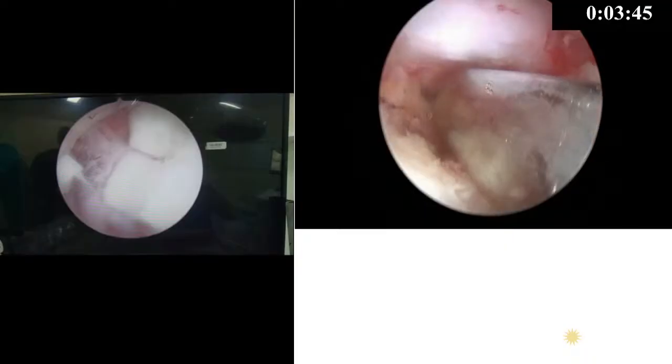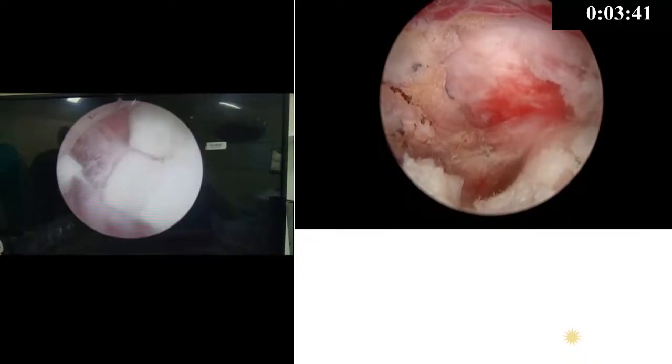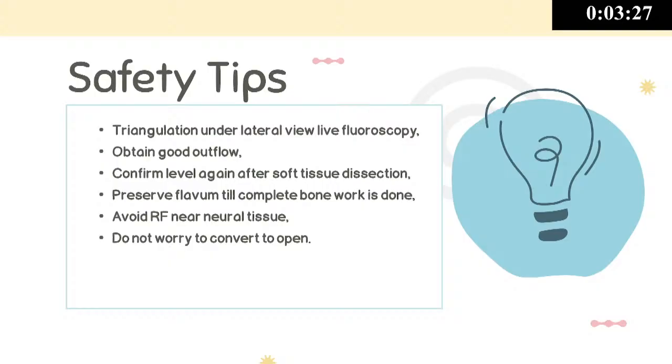You have to be very careful. In cervical spine, there is no scope of retraction of the dura or even the nerve root. No, you can't. Even your hook, when you use it, it has to be so soft. Like I prefer using the hook which comes in the microneurosurgery set. It is better to use that over here. So once the annulotomy has been done, a discectomy has been performed, we simply take the plasma ablator inside, coagulate the part of the disc and perform an annuloplasty.